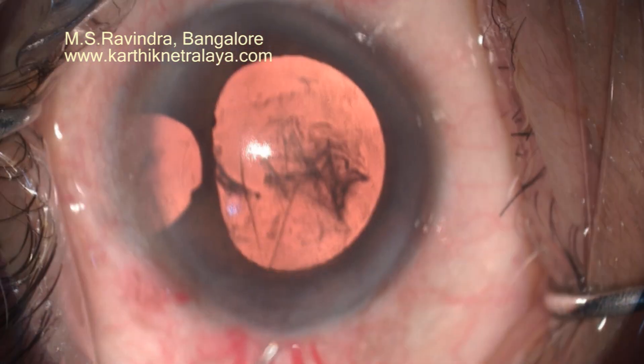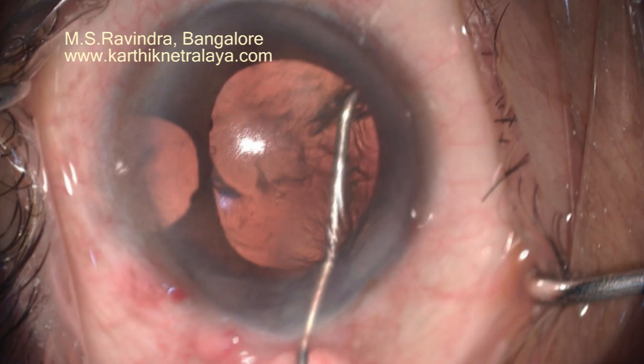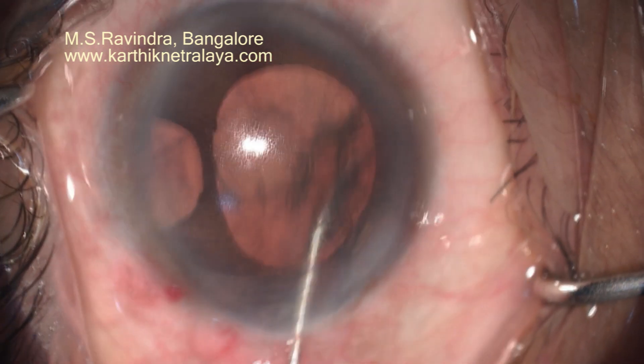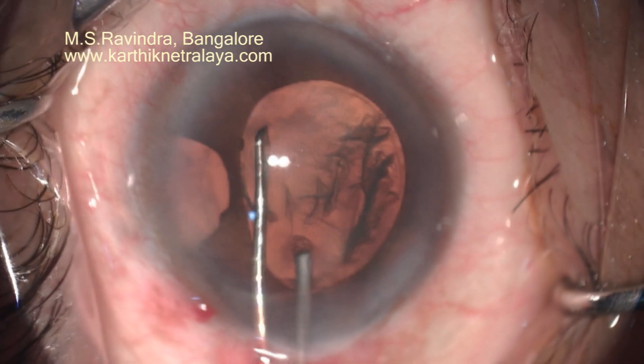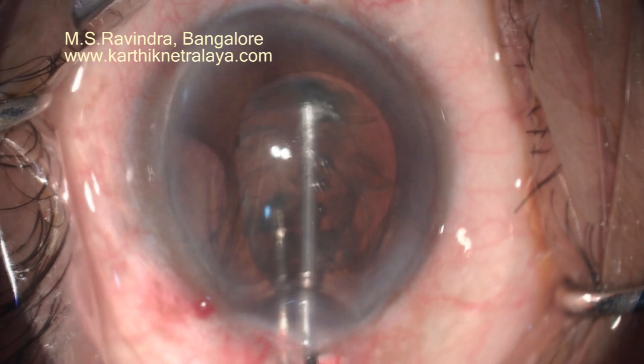The tunnel is enlarged with a blunt keratome. Superiorly, I expect zonular dehiscence or zonular weakness, so I avoided that area. Single point hydrodissection was done from the inferior quadrants.